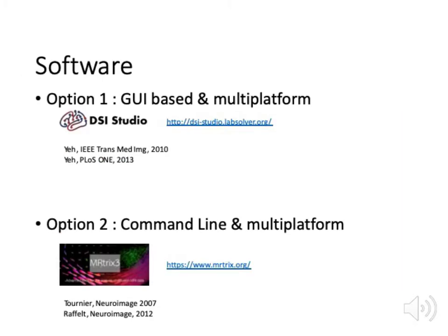I recommend a GUI-based software known as DSI Studio to perform this analysis, but as usual, if you prefer a more powerful command line software, you are welcome to explore MRtrix software, which can be downloaded from this site.